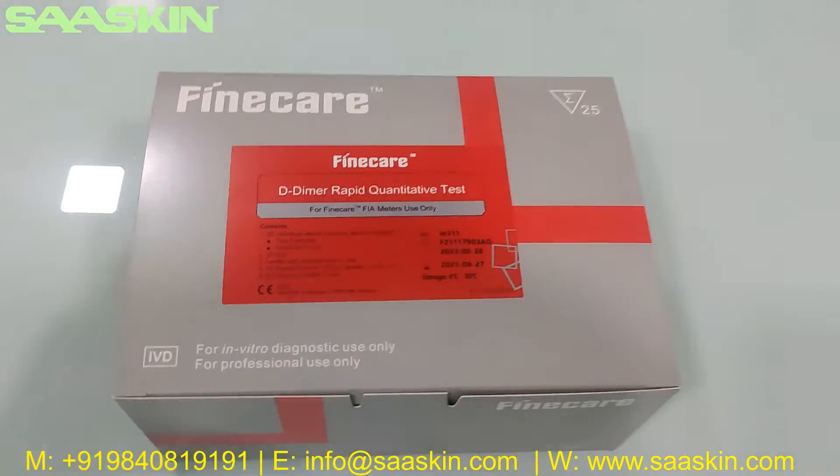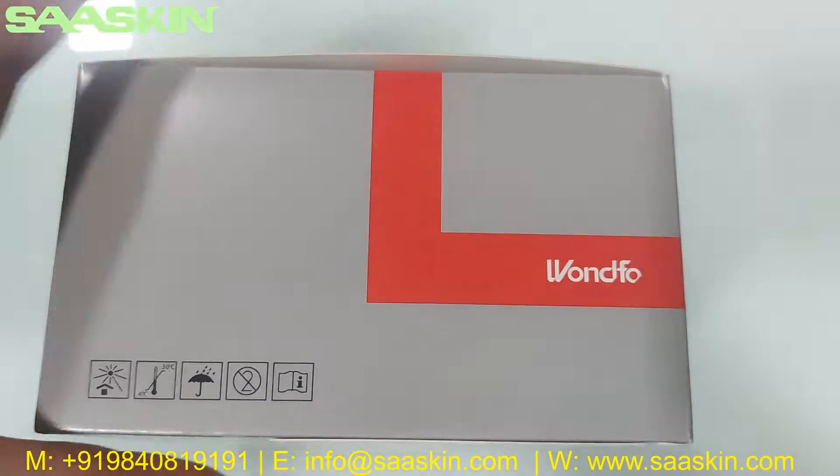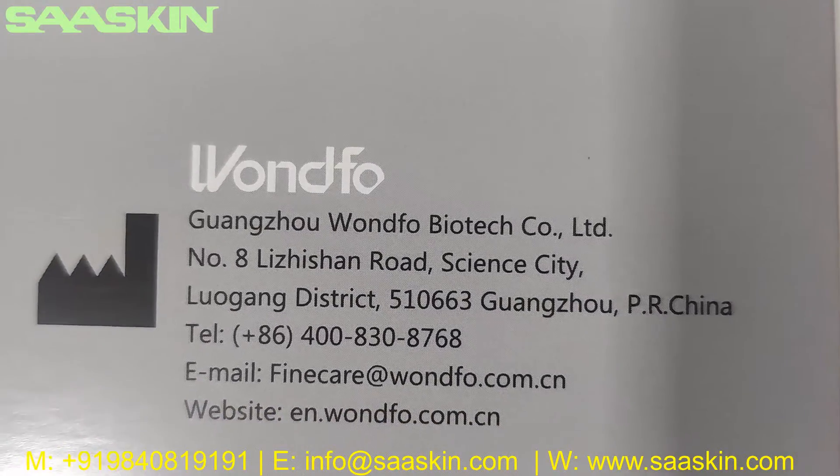I'll just go around this box for you. You can see this is from Wondfo, from China.